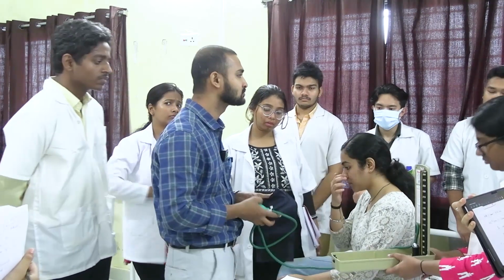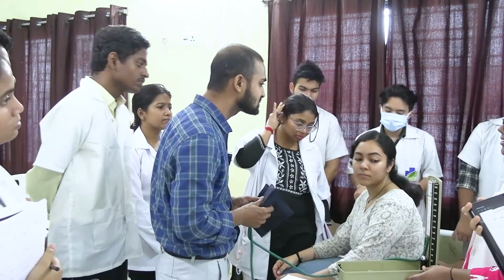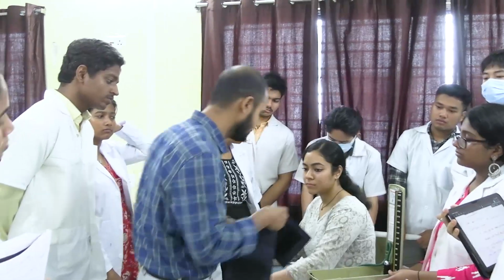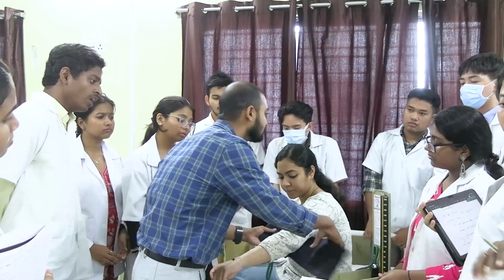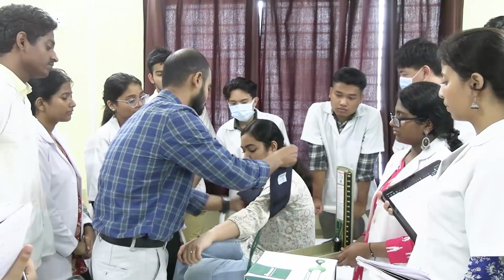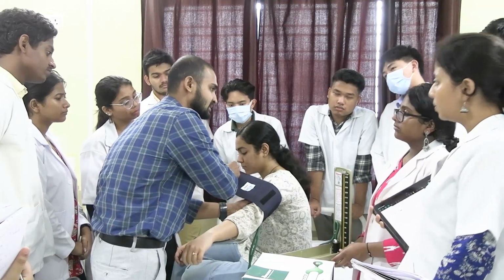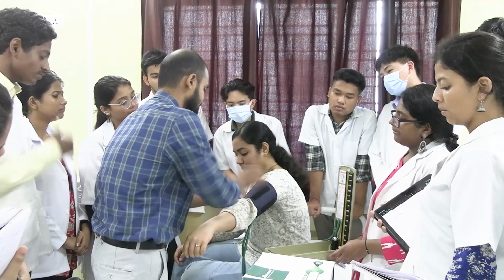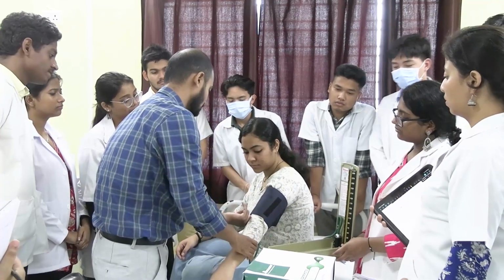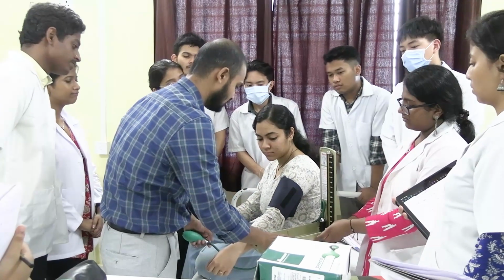So now we'll go to auscultatory. So her BP was 96 mmHg by palpatory, right? Similar way. So now we have the idea that our BP is around 96. So now with the help of the palpatory, we'll go for the auscultatory. And the level of the heart.